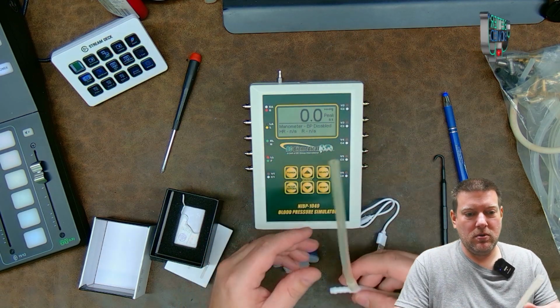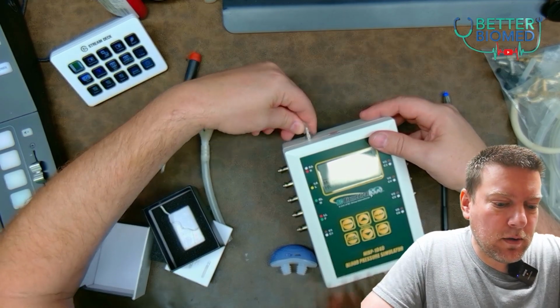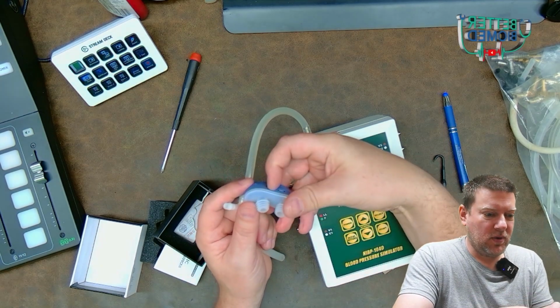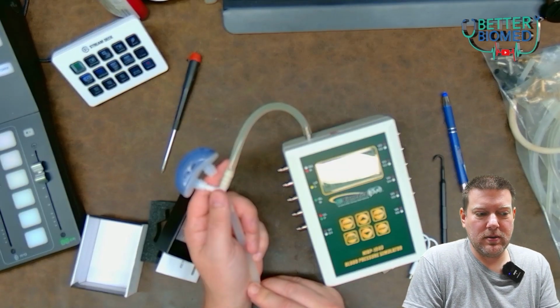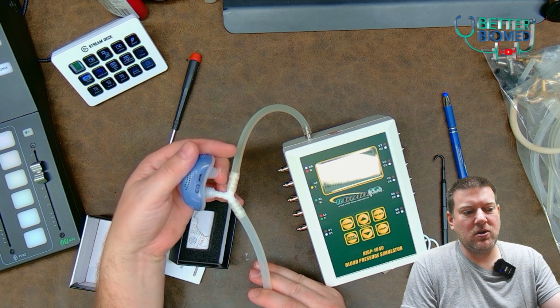Okay. And how about this? Put this guy here. Oh, yeah. Not an issue. Okay. So we're going to go ahead and turn this guy on. I'm going to plug this guy in. I'm going to occlude it. We have absolutely nothing. So let me occlude the other nostril.